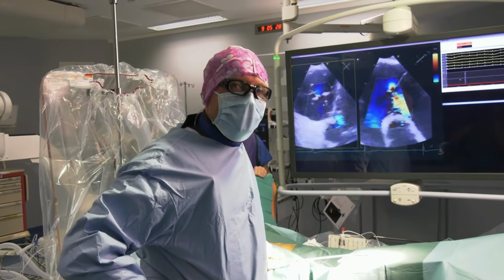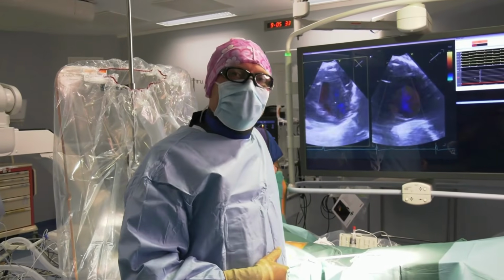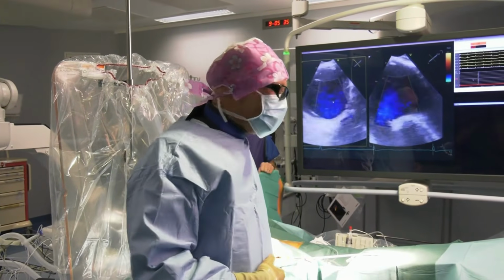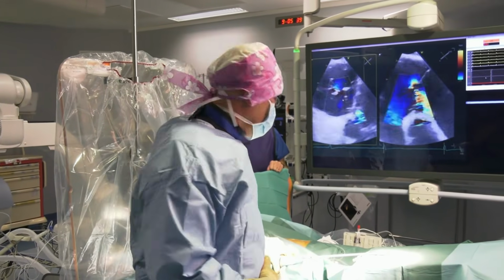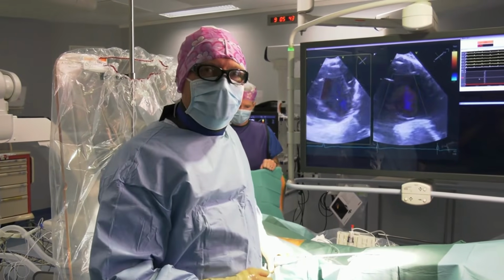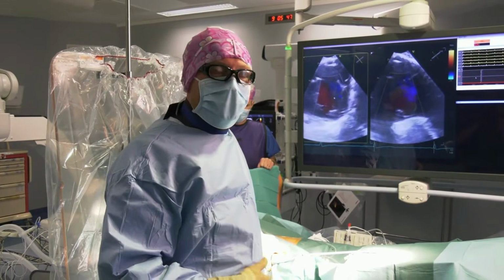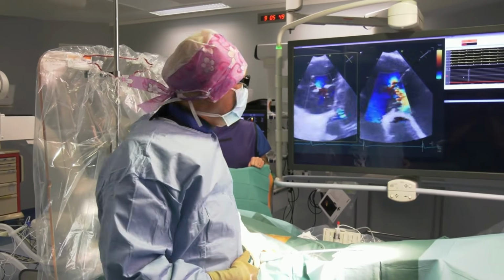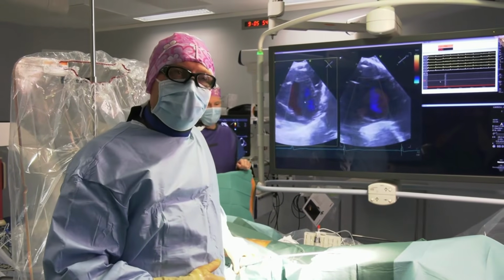Hi, my name is Guillaume Laurent. I am an interventional cardiologist in the University Hospital of Rennes. So welcome in the cath lab, where with all the staff, we are going to treat the tricuspid regurgitation of these patients thanks to the TriClip device. So it's an edge-to-edge strategy. Erwan Donal presents you the case of these patients.